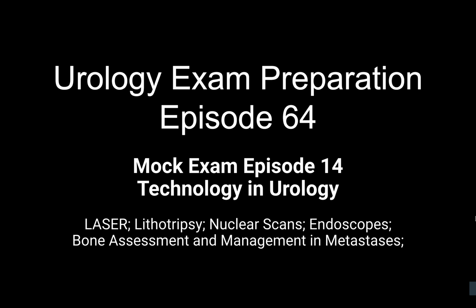You are doing a flexible cystoscopy in a hematuria clinic, and a newly joined SPR is asking you why we are using flexible cystoscopy rather than a rigid cystoscopy, and what is the advantage of it. How will you explain that? So I would explain that flexible cystoscopy as against rigid is like passing a catheter. It can be done under local anesthetic jelly, and because it's flexible, we're able to manipulate the tip of the camera to have a complete view of the bladder.